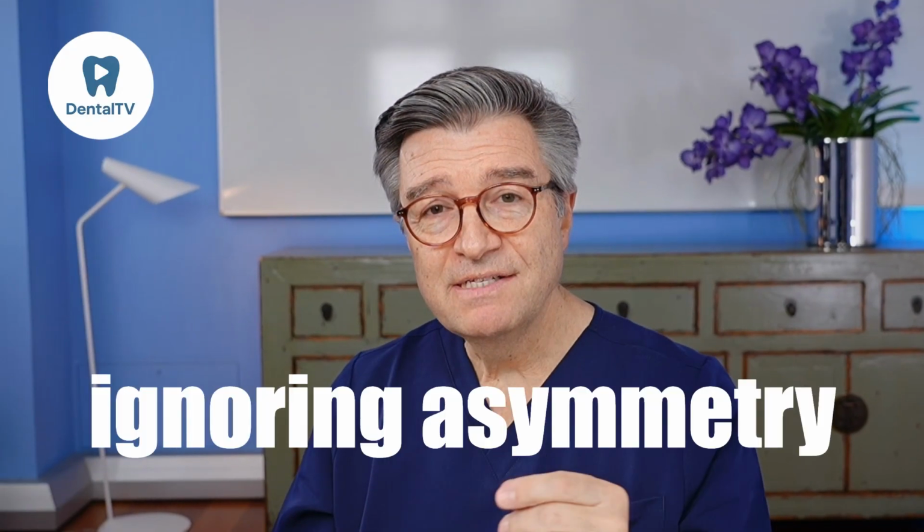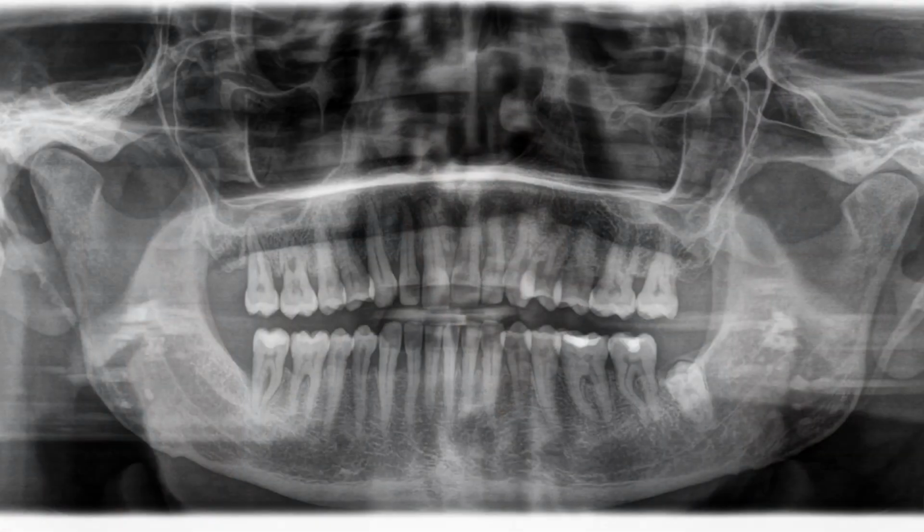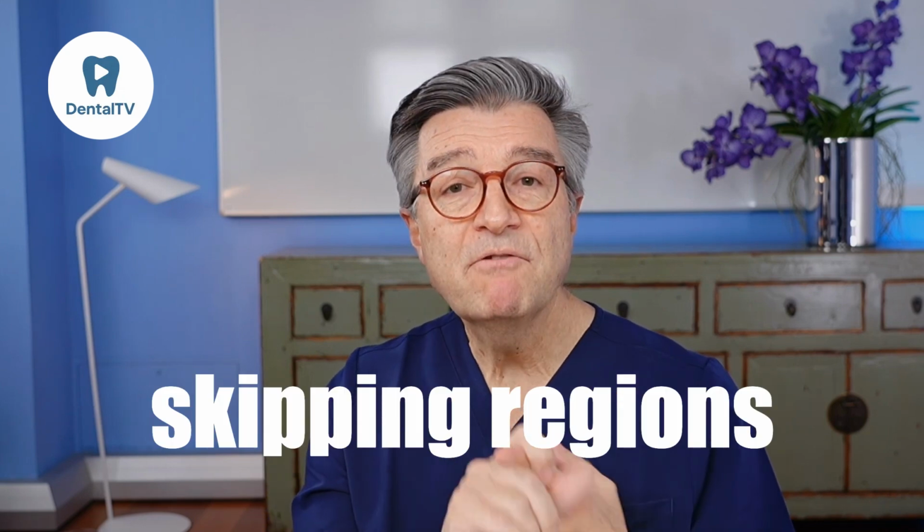The third error is ignoring asymmetry. One of the most powerful diagnostic tools in 3D is comparing the right and the left side. The human body is symmetric, and deviations from that symmetry often indicate an underlying problem. The fourth error is skipping regions. A complete CBCT evaluation requires a systematic review of the entire volume, including the orbit, sinus, nasal cavity, TMJ, alveolar ridge, apical areas, posterior regions, the canal pathway, and incidental findings.